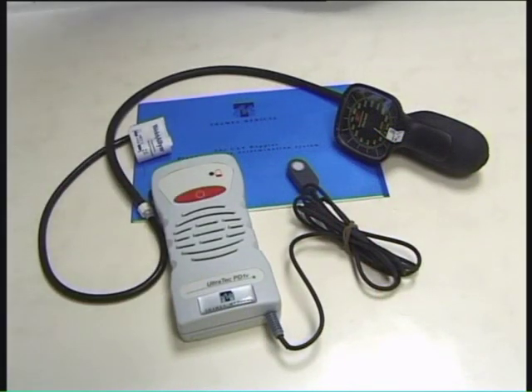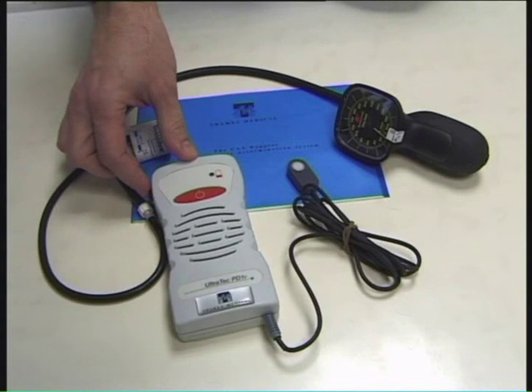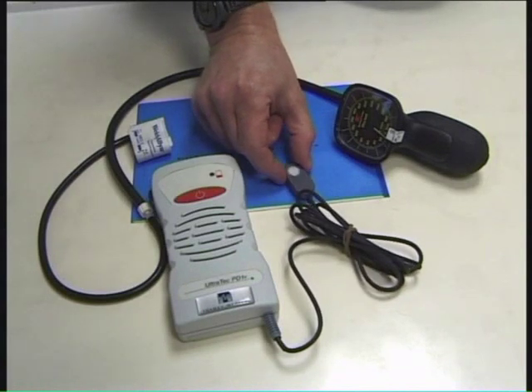This is the CAD Doppler equipment supplied by Thames Medical. This is the Doppler unit itself, with an on-off switch on the front and a volume switch on the side. And this is the probe that actually contains the Doppler crystals that are used to detect the flow of blood through the artery.